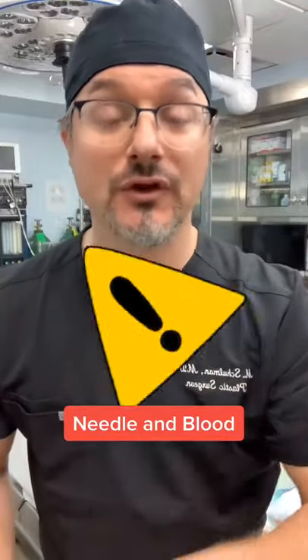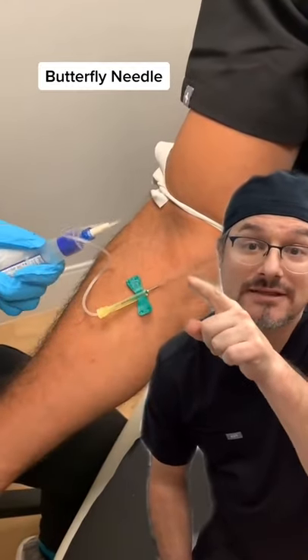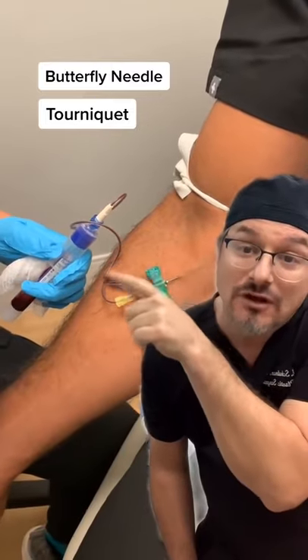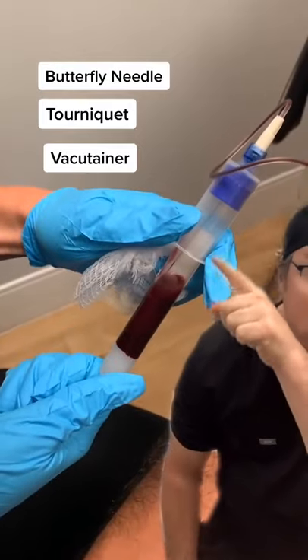Here's your warning: keep scrolling if you don't like blood or needles. This is an actual blood draw. That needle is a butterfly needle going into the vein, that's a tourniquet to make the vein big, and that's called a vacutainer — the blood is flowing into that container with suction. Look at that stream of blood.